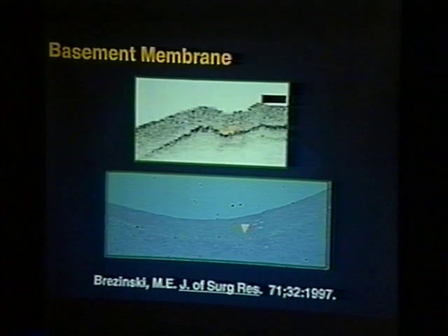And this is a little bit out of sequence, but I wanted to make a point. Those were all hard plaques on the previous images. And then besides identifying the plaque at high resolution, we want to characterize it. Now, this opening just happens to be the size of the artery, so you don't see the lumen. But the hard area, the soft area, and the normal tissue are clearly differentiated in the OCT image, which you would not be able to do with ultrasound.